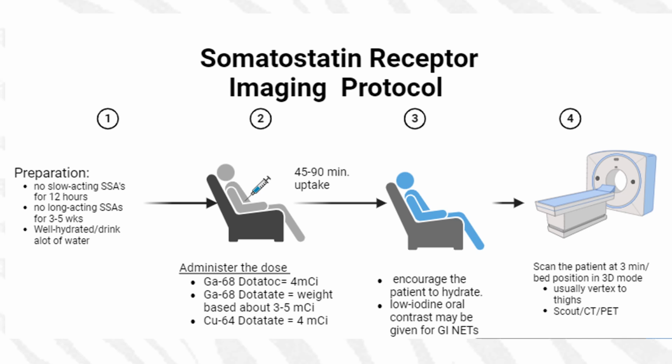If you're using copper, you may need to increase that. If you have a digital scanner, you may be able to decrease that. And then usually this is vertex to the thighs with scout, CT scan, and then the PET.